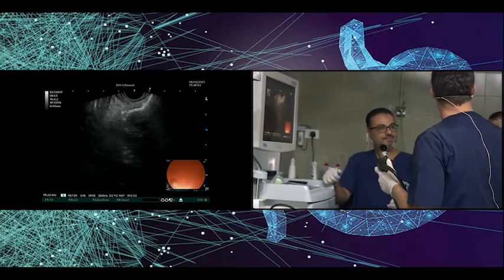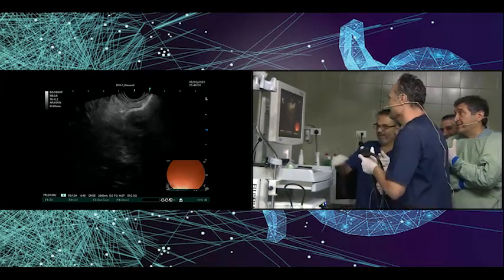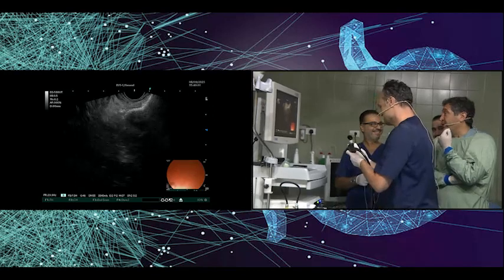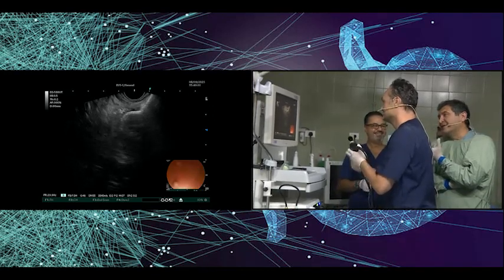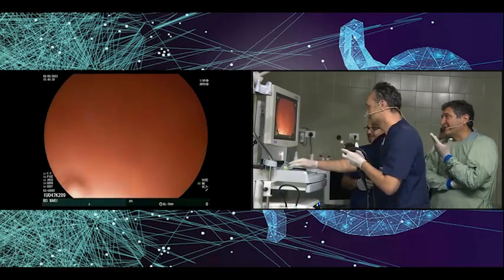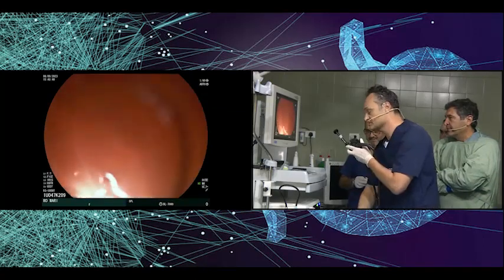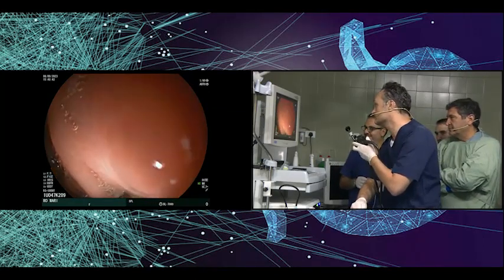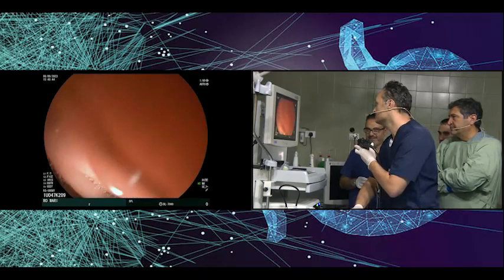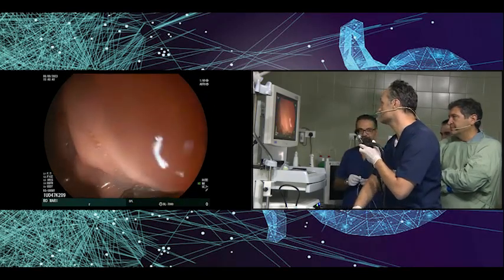But it is because I am old-fashioned. And that's a big issue, because old-fashioned endoscopists are not used to deploying stents without seeing. So it's a new approach that we have to get used to. So you have to insufflate. Sometimes it is not so easy, but you have to insufflate.